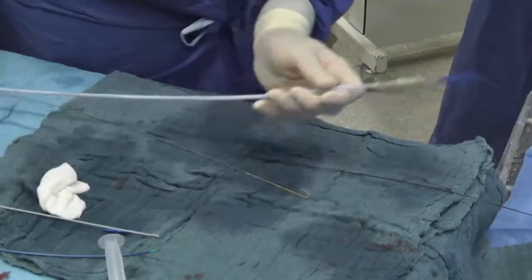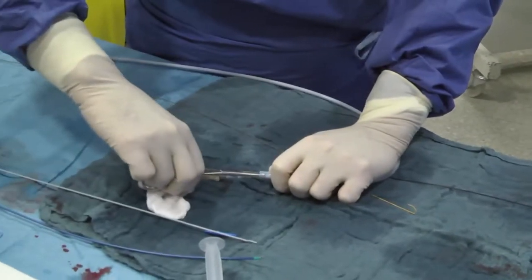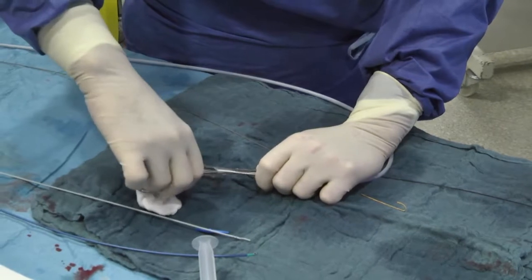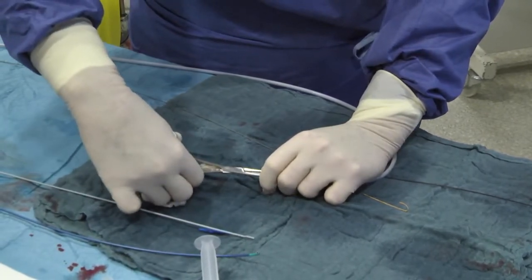Usually when I have to turn it a little bit. So usually when I put in that stent, I'm very happy to get out without dislocating the stent, and that's about it. Now the folded stent, in theory, you can put it.